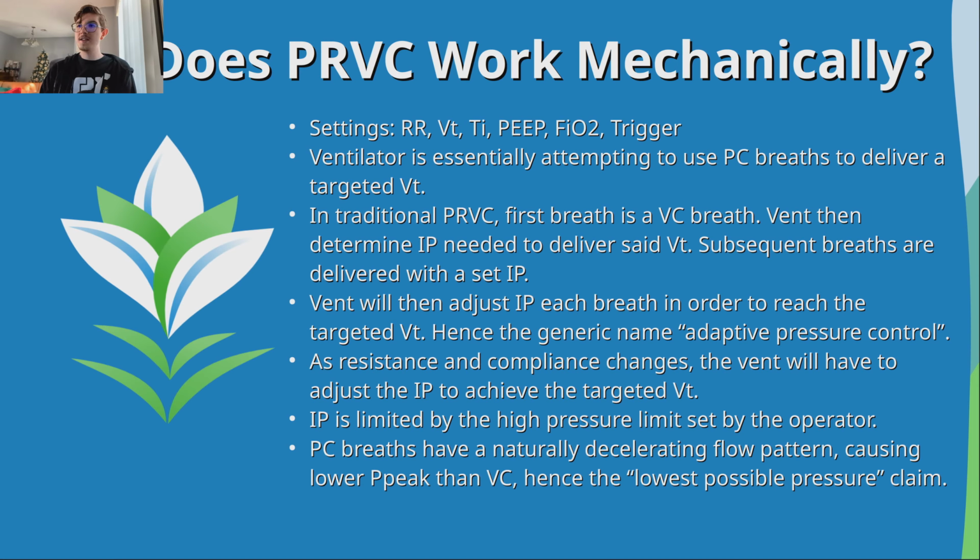Now, because these are pressure-controlled breaths, because they have a set inspiratory pressure, they have a naturally decelerating flow pattern. This causes lower peak pressures than volume control, hence the claim that it's delivering you the tidal volume with the lowest possible pressure.